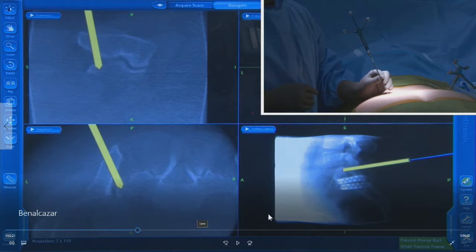On this CT image you can see the paraspinous musculature pretty obviously right here, the posterior superior iliac spine here, and the gluteal musculature right here. We're in this little dead space where there's no muscle — so it's skin, fat, bone. We're not going to destroy any of the muscle or gluteal tissue.